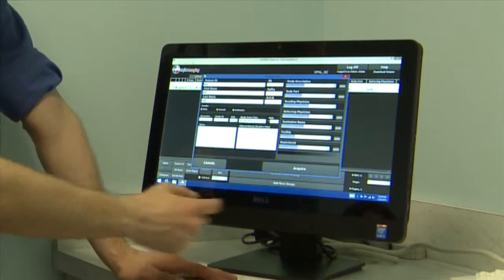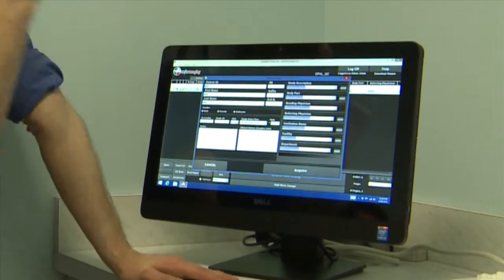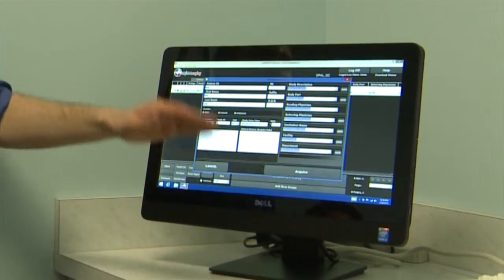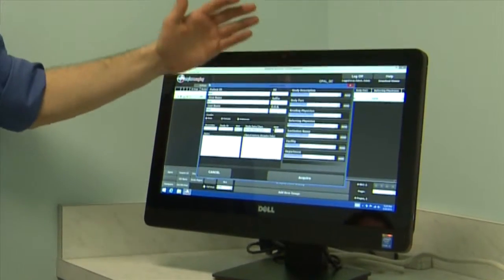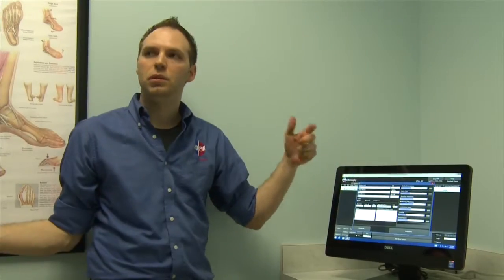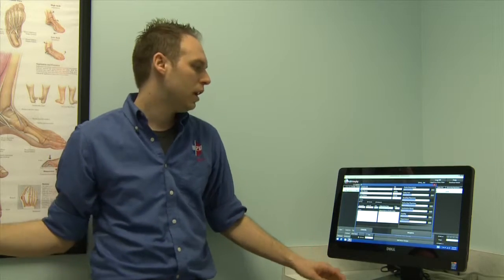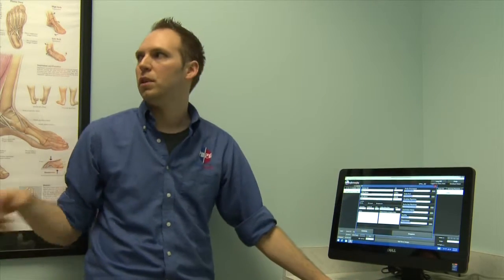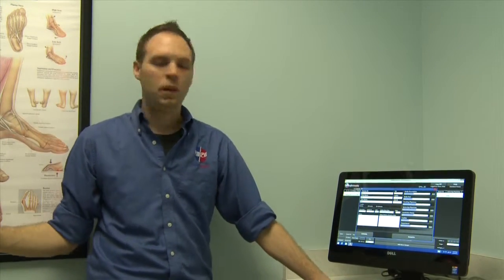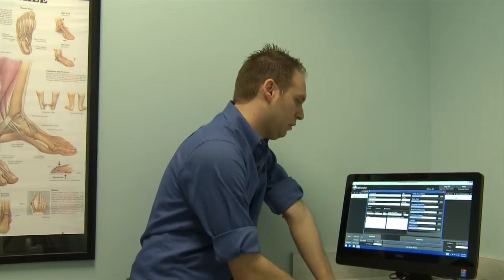For institution name, click the add button on the right-hand side, type in your practice name, and it'll stay in there. It defaults to the last selected one, so it'll always remember. Just keep in mind that if it's a different doctor, make sure you change it to the correct physician.